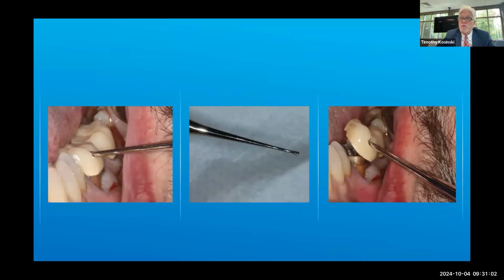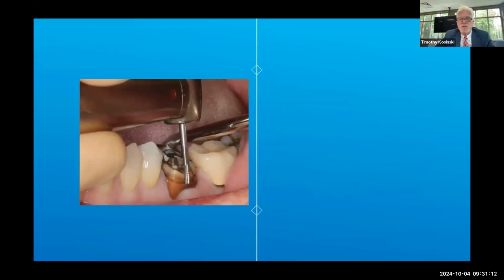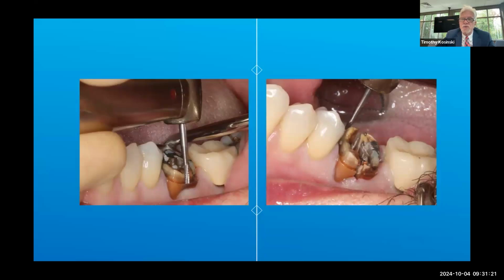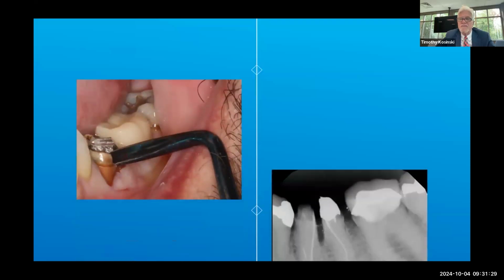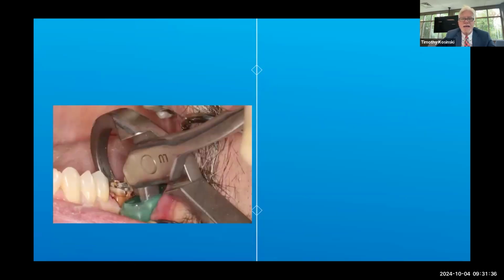Now, if I weren't removing this tooth, I could use this crown as my temporary restoration while you're fabricating the final new crown. But here I'm going to remove the tooth. In mandibular molar teeth, if there's divergent roots, I normally like to section it. So I'm taking a 557 long surgical burr, and I'm sectioning to the furcation area. I want to make sure that I completely cut through. So I'll take a radiograph, I'll elevate, loosen it a little bit, and then I can remove these mesial and distal roots as if they were single rooted bicuspid teeth.